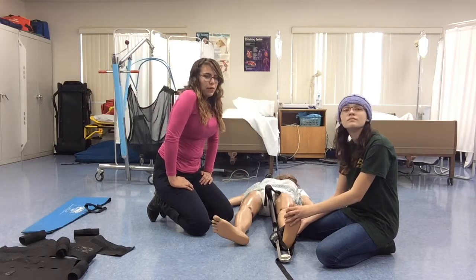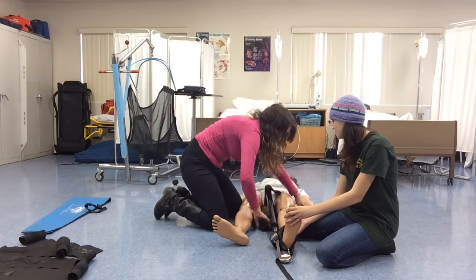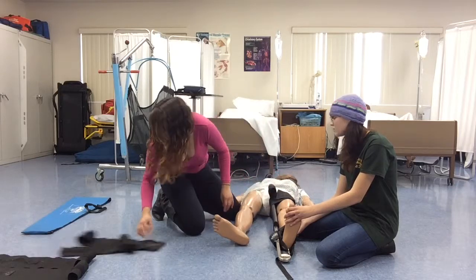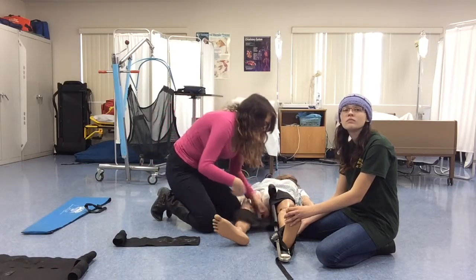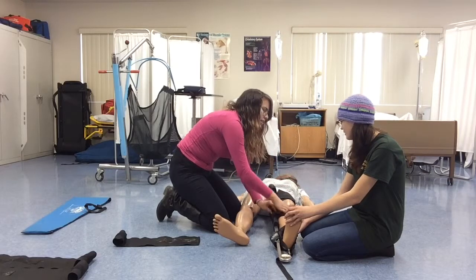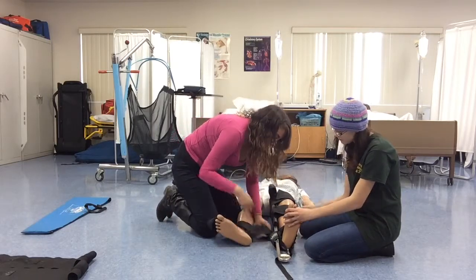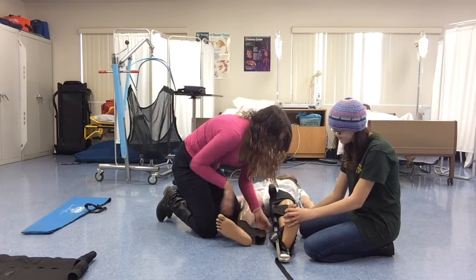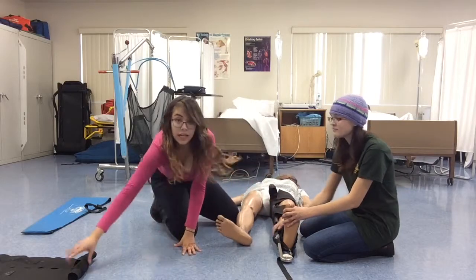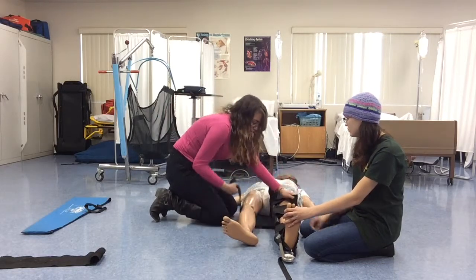Okay, so I'm going to be placing the straps. So first is the thigh. So first the thigh, then we're putting it on the ankle. And because this is a unipolar, it's the only one that can go right above the ankle. Or did I say ankle? Not the ankle, the knee, sorry. Then we're going to put one above the ankle. Now this is the knee. Okay. And then I'm going to get the longer strap, and then I'm going to put it under both ankles and knees, and then I'm going to pull together.